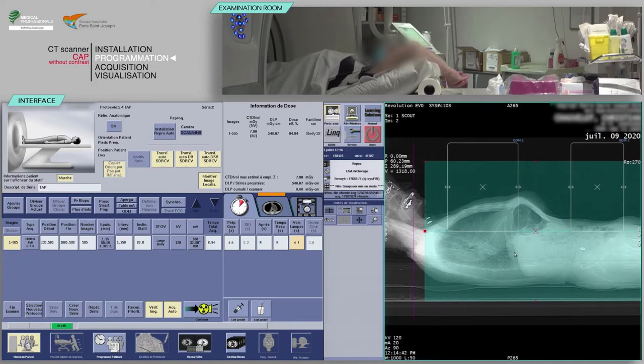Check your coverage on the sagittal localizer at mid-thickness of the patient's body. Depending on the instructions of the radiologist, it could be indicated to stretch the acquisition in order to include the scrotum or the scapula.